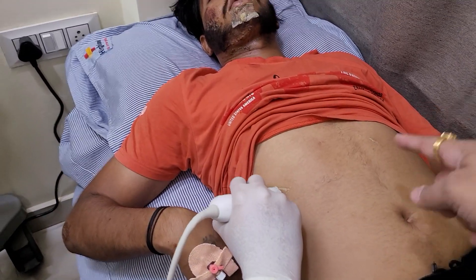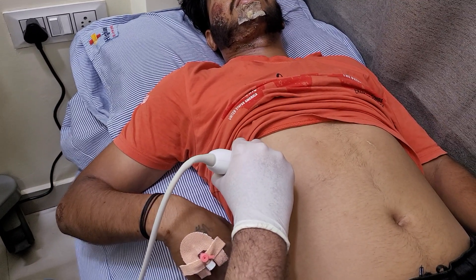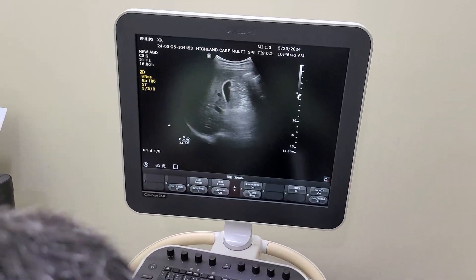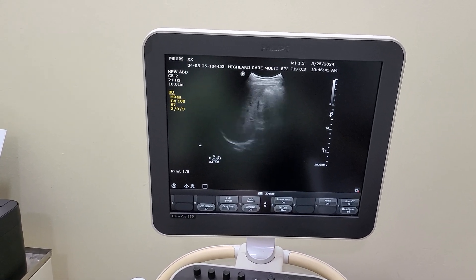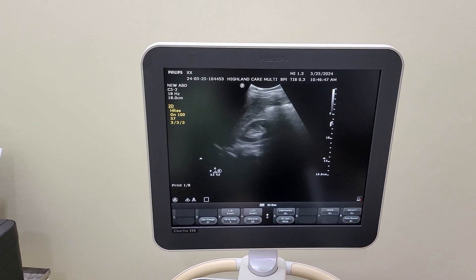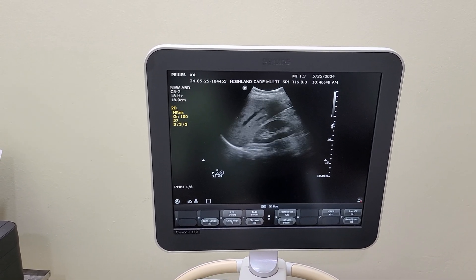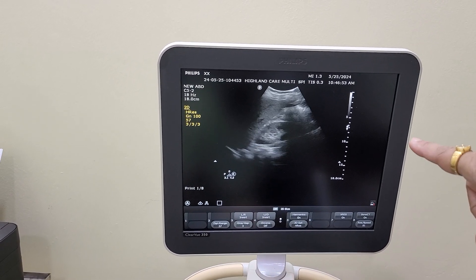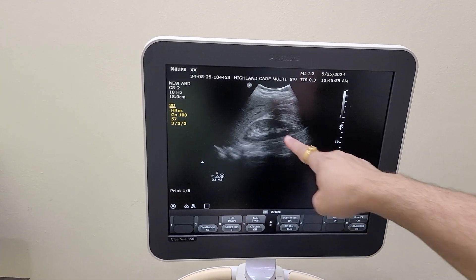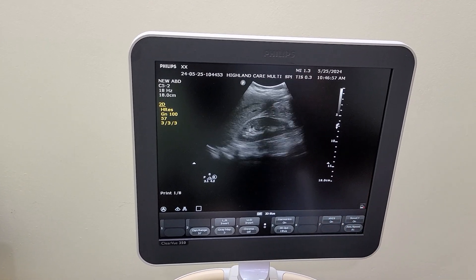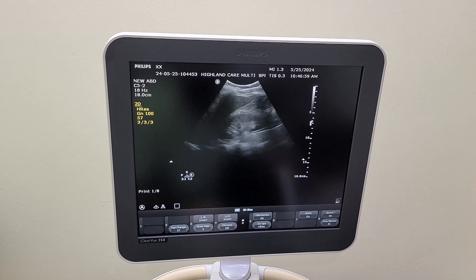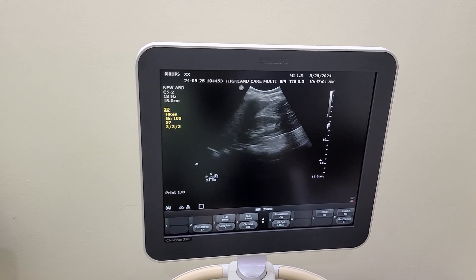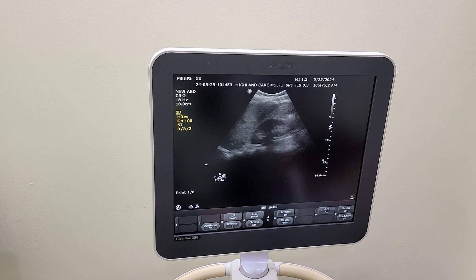The next step is to go for HRP. We drag the probe and take it towards the HRP — here we have the hepatic window. In a FAST, we concentrate more on the pouches to look out for collection. This is the HRP and there is no significant collection here. A hypoechoic accumulation would signify that there is a collection.